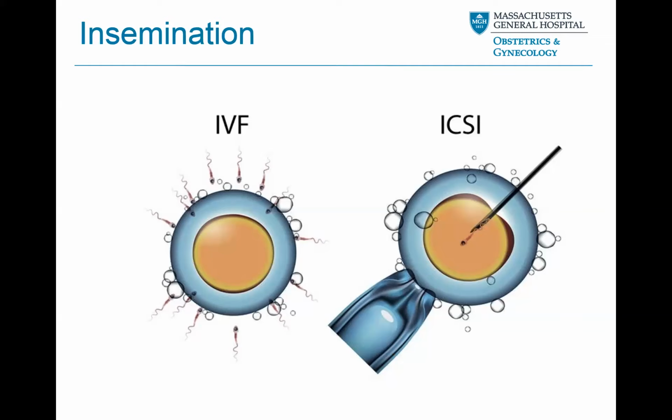We're also looking at other structures on the sperm. We're looking at the head. We want the head to be a normal shape. We want the neck piece of the sperm to be normal in its proportions to the head, and also the sperm tail. We're looking at features on the tail to see which one is the most morphologically normal when we're selecting it for ICSI.